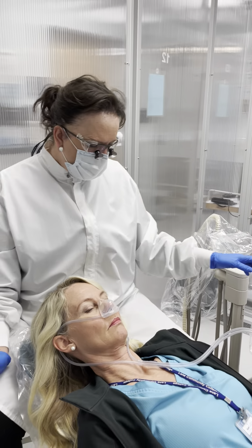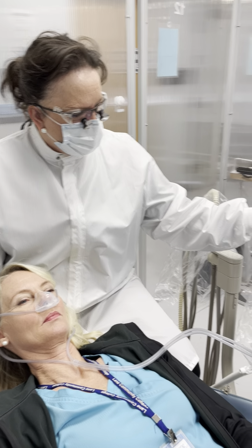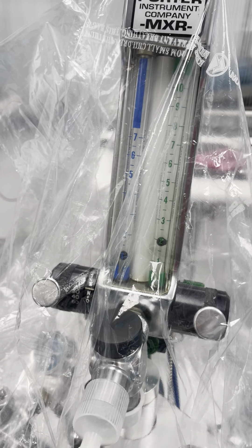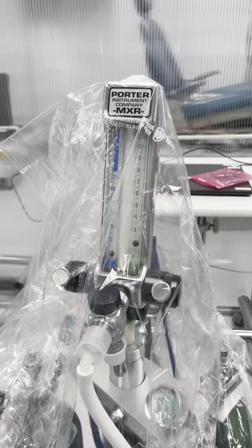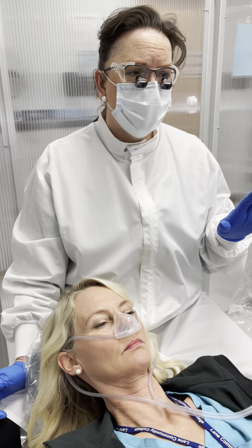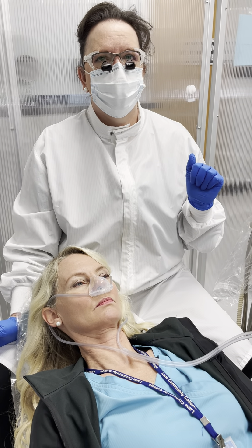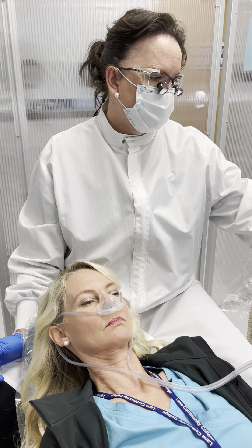When you're done, instead of just turning everything off, bring the patient down slowly — it's healthier for the patient. Reduce by half a liter, keep them there for about a minute, then reduce again until she's on straight oxygen. Leave them on oxygen for at least five minutes to make sure the patient is ambulatory before they leave the facility. Before they leave, do post-treatment vitals. There's also a new chart note for WDC that we'll show you.